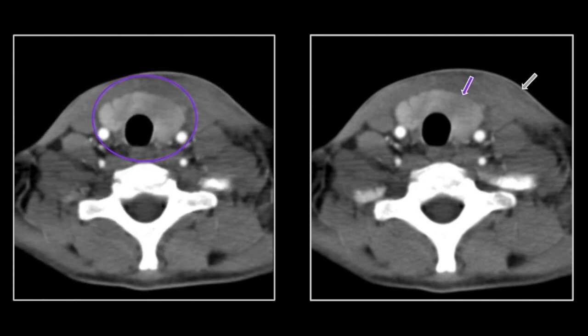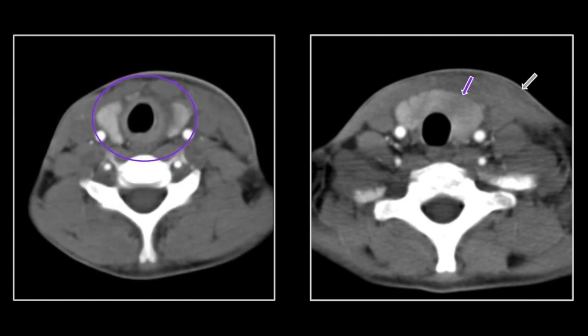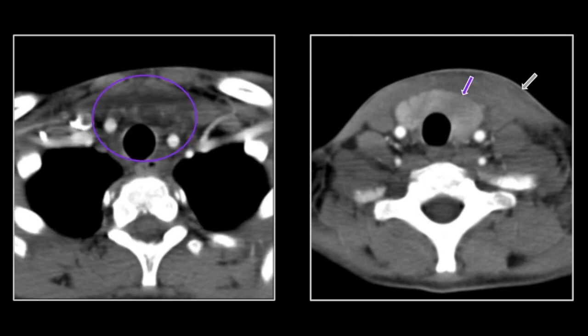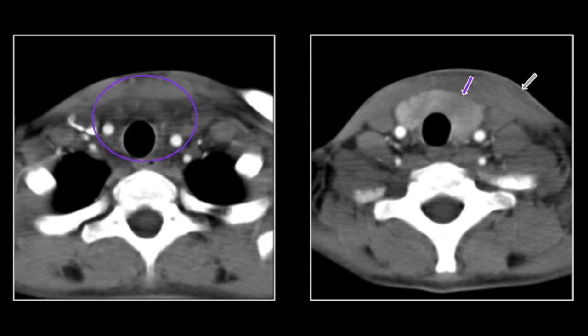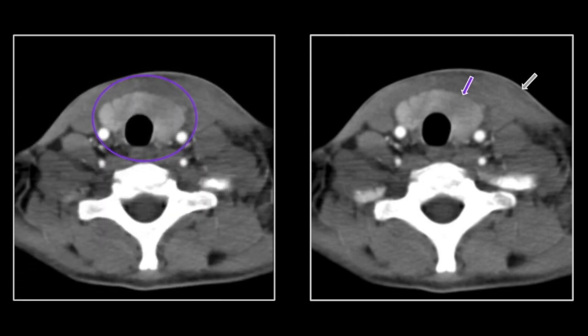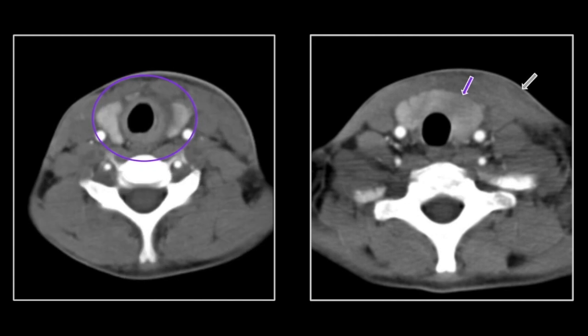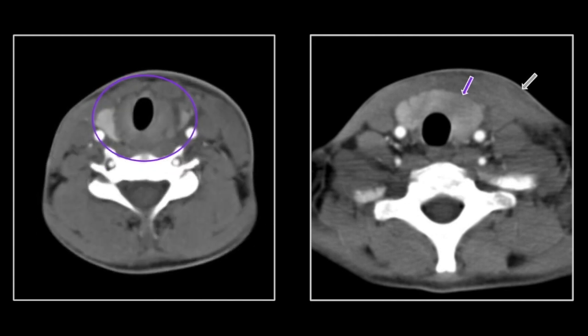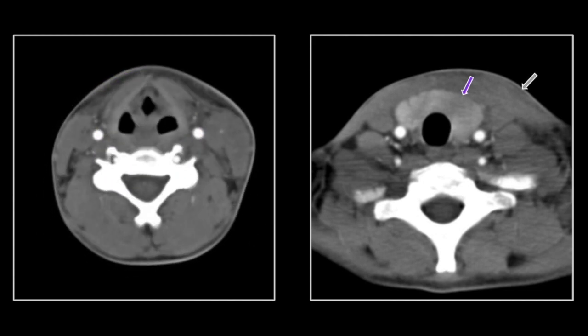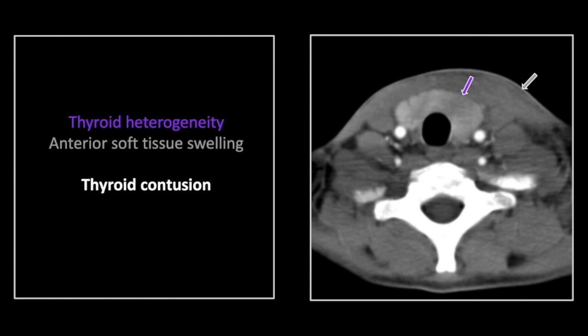There is diffuse enlargement of the thyroid. Note again that irregular, ill-defined hypodense region consistent with a contusion. So that is a thyroid contusion resulting from a direct blow. This patient was riding a dirt bike and hit a clothesline.